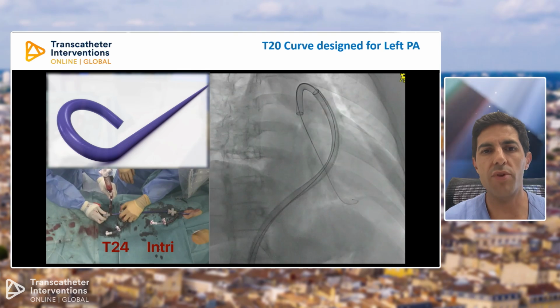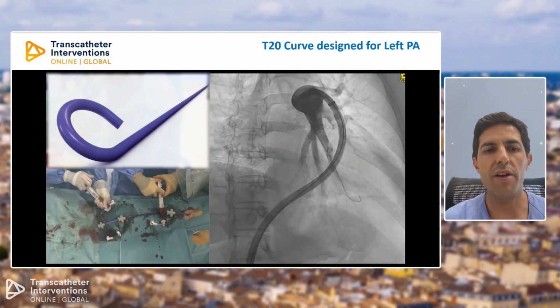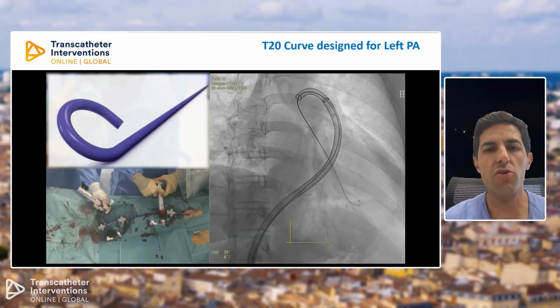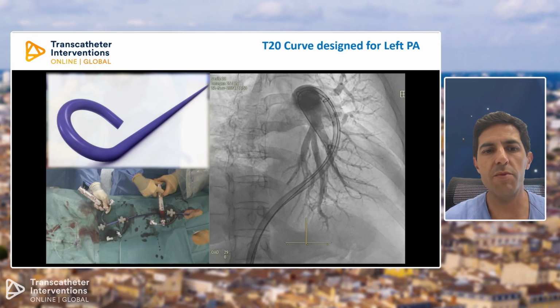And you can see now that we are orienting the catheter to the thrombi. This would be an aerial view, and we are aspirating from the most distal part, okay? The T20, and you can also double aspirate from the T20 plus the T24, okay? We clean this artery for this particular case. This is a different case from the first one, okay?